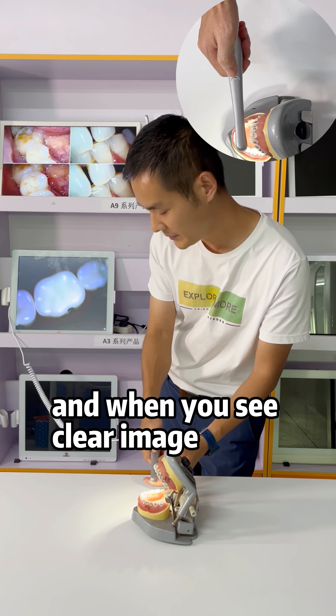Second, you hold it like a pencil, and with your forefinger on the button, then move the camera to the teeth slowly and touch it to get the photo. Like this.